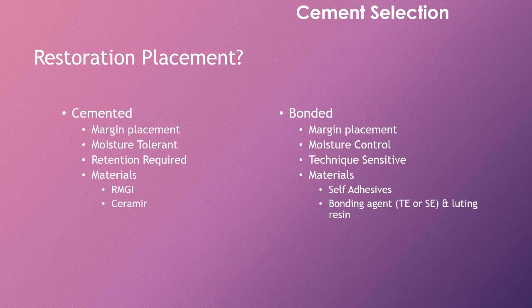Now, I've seen people do kind of 3/4 crowns and they call them veneers. I might be inclined to take a little more tooth structure away and have margins above the gum line and use a cement as opposed to an adhesive resin. Let's face it, if we're doing that much tooth reduction, it's not much more to go ahead and make a crown, something that's more durable and potentially has some good upsides to having removed a little more tooth structure. It's not to say adhesive bonding is bad, but sometimes a cement, I think, could be better, especially if you're removing that much tooth structure.